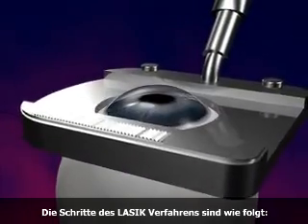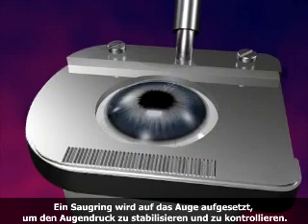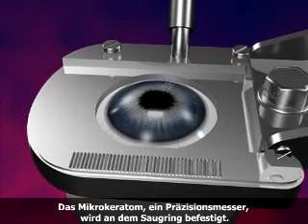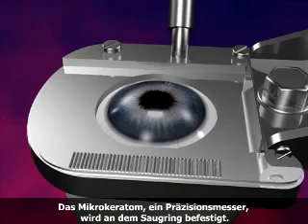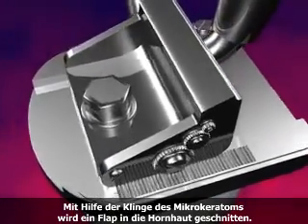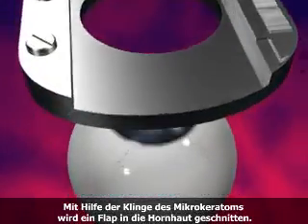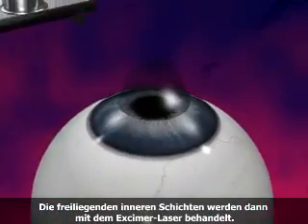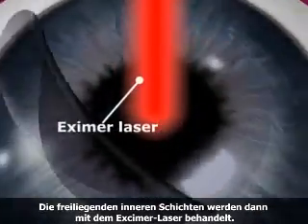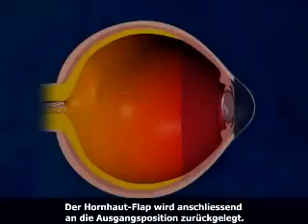The steps of the procedure are as follows. A suction ring is placed on the eye to stabilize it and check the eye pressure. The microkeratome, a cutting instrument, is attached to the suction ring. The blade of the microkeratome is used to cut a flap in the cornea. The exposed inner layer of the cornea is then reshaped with an excimer laser. The corneal flap is then returned to its original position.